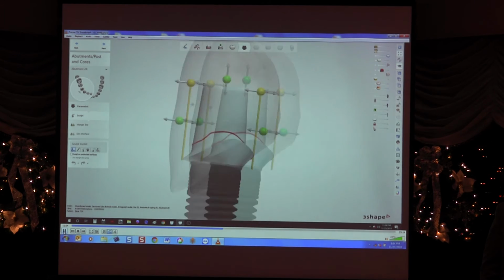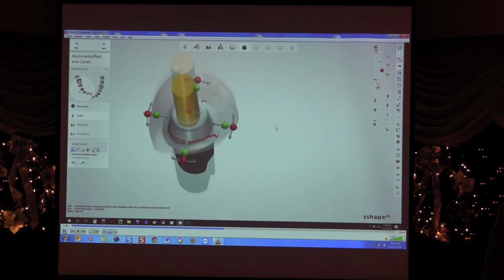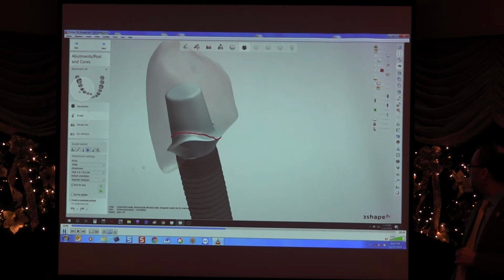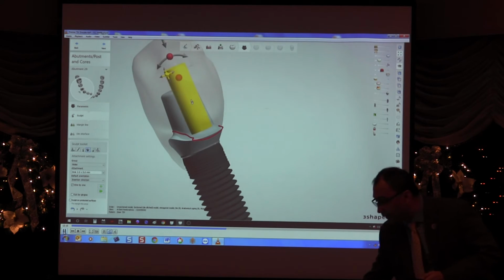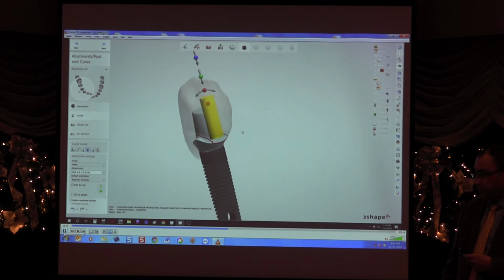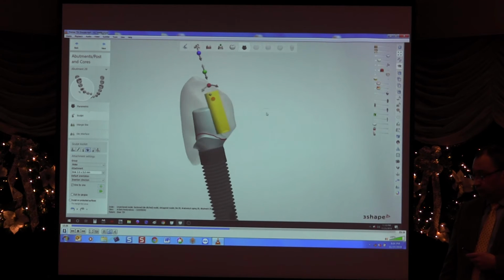So this is something where there is no right or wrong. It's more important that he interacts with you to make sure we take care of your personal preferences, but that we do everything we can to create that perfect crown prep with that perfect emergence profile. That's where I think more and more interaction with TeamViewer comes in. Now I can have you on the system live, I can snap a screenshot or two and send them to you in a matter of minutes, so that we get more and more interaction.